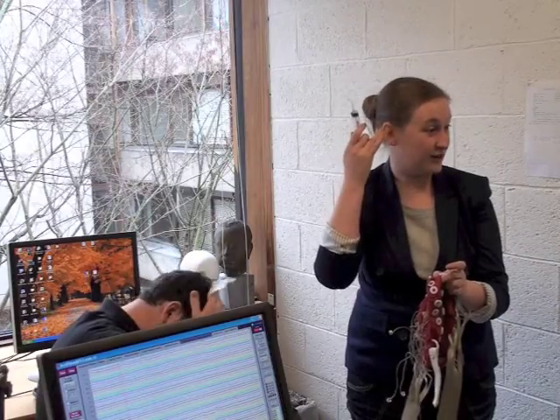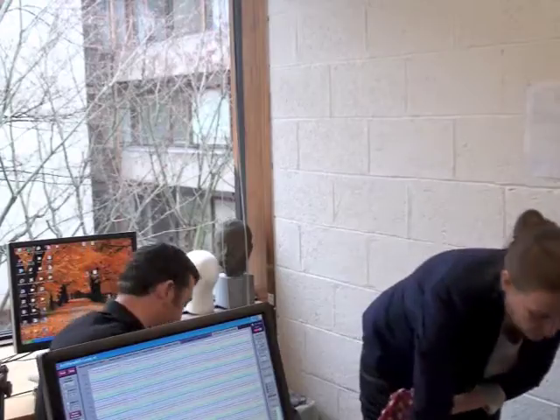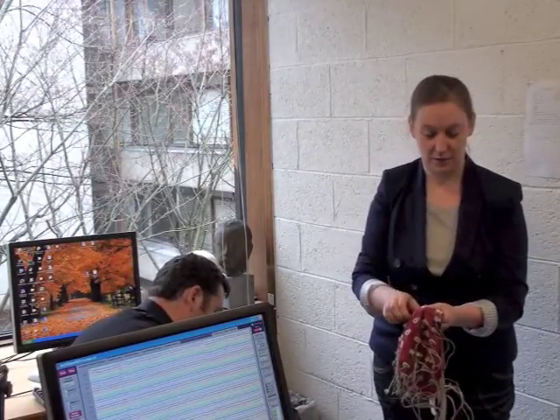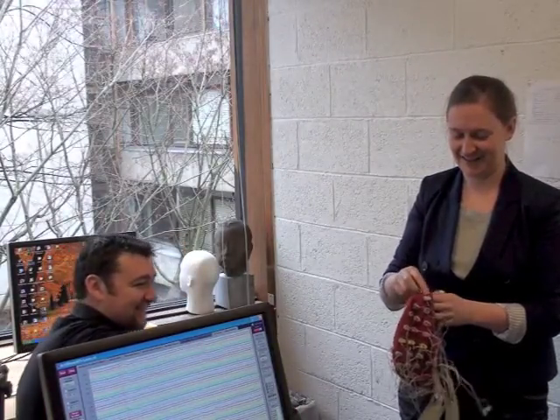You have to make sure the gel is taken out of these, because if it's not, it will harden over it, and the next person won't be able to use the system. They'll have to go and clean it, and then the cap will be wet and you couldn't use it on the participant. To ensure that it keeps its shape, you leave it to dry on Billy over here. Just put it on his head and it will dry normally. Billy's the white one. I wouldn't put it on the metal one. The other one is just some famous psychologist guy.